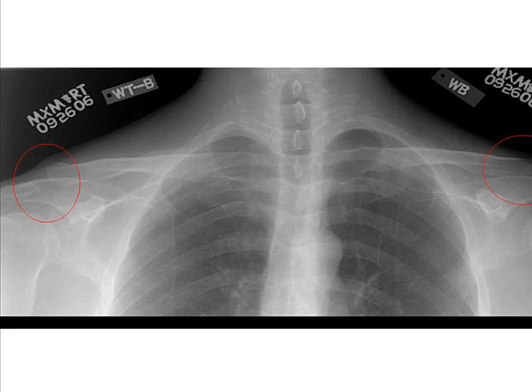An AP projection of the acromioclavicular joint should demonstrate both acromioclavicular joints with and without weights. Appropriate contrast and density will demonstrate both soft tissue and trabecular bone.